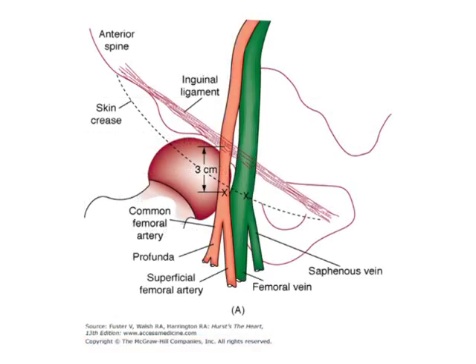To identify the puncture site, first locate the inguinal ligament, which connects the anterior superior spine and pubic tubercle. Remember that the groin crease should not be used as a landmark to identify the puncture site, as it can be deceptive, especially in obese patients. The femoral artery passes under the inguinal ligament and can be located by its pulsation. Keep in mind that the femoral artery is bordered medially by the femoral vein and laterally by the femoral nerve.